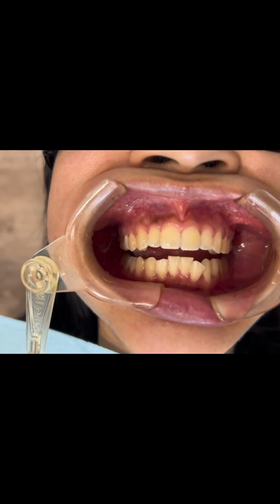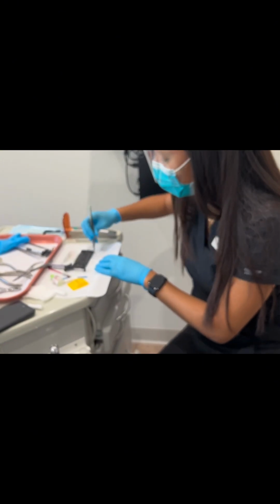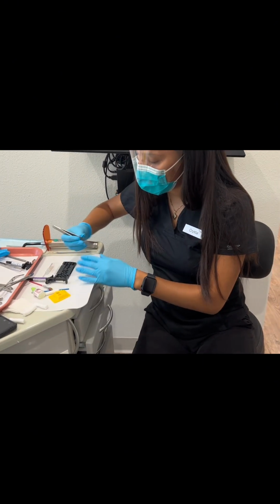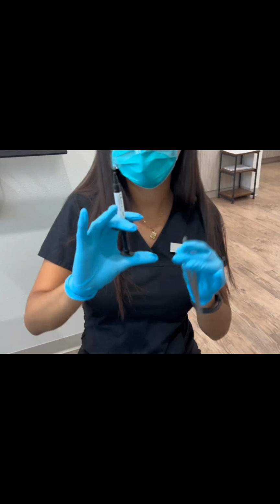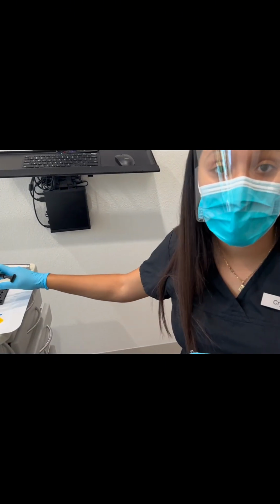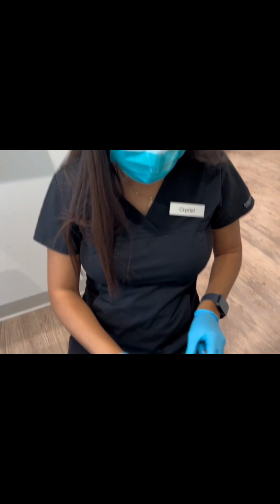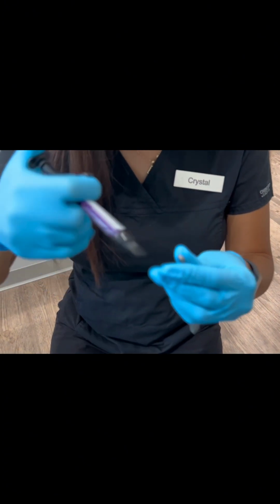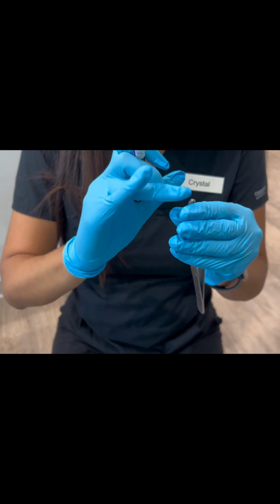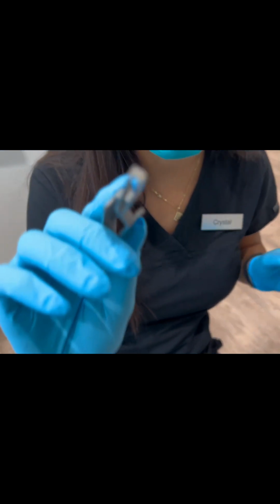Now we're gonna go ahead and move to the next step, which is actually placing the brackets on the teeth, all right? So notice, I grab the bracket. It's usually labeled on your actual card what bracket it is, okay? I make sure my fingers are nice and dry. You're going to put a pea size of glue on the bracket. You're gonna just tap. Make sure it's nice and flat on the entire surface of the bracket.